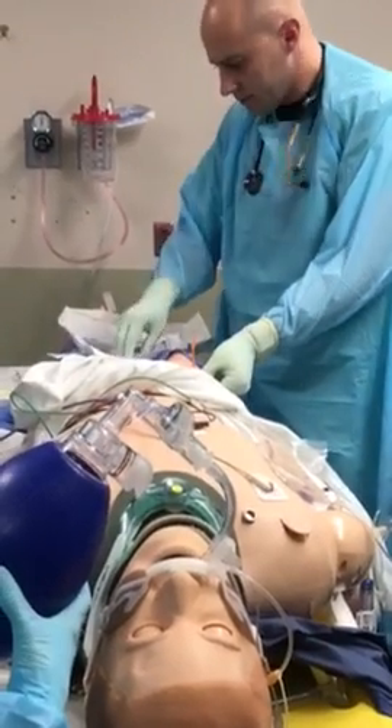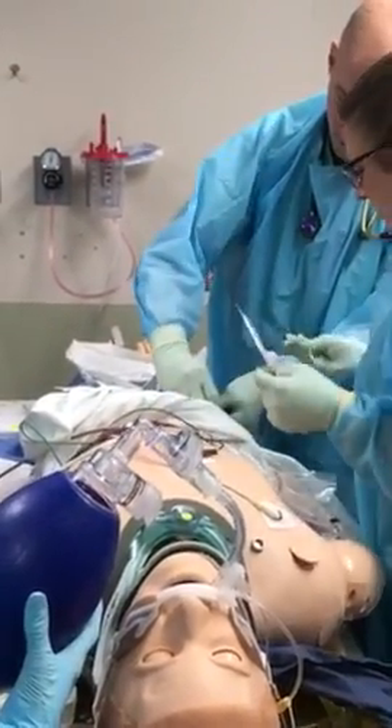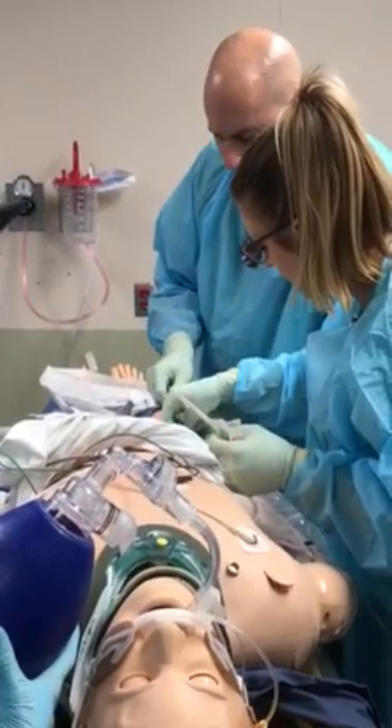I'm reaching. We're still sitting at 30. We're at 30. Lock that down.